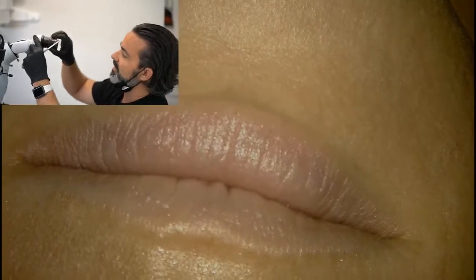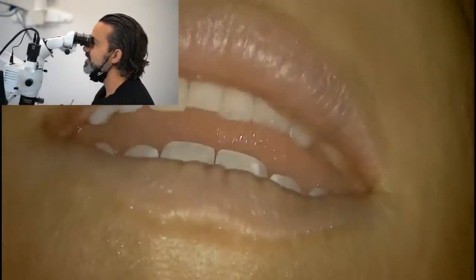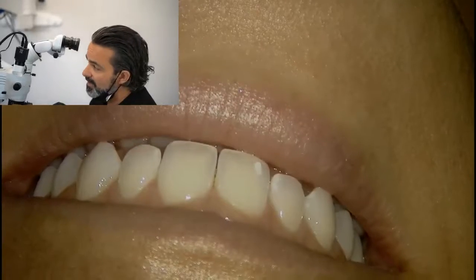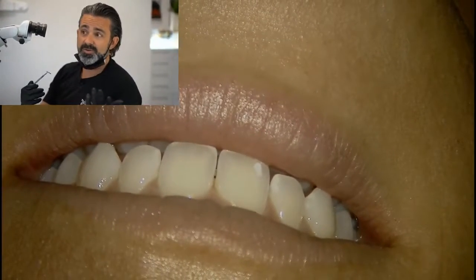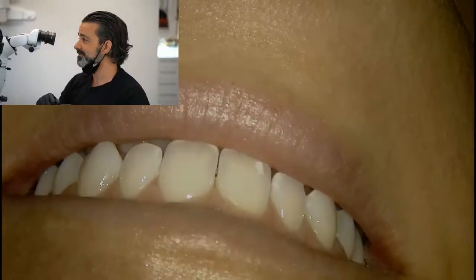That would be a plug for why you would have the caps on, because then at least your eyelashes aren't butterfly kissing the lens, and you keep it clean. But it's just the same if you wear glasses. I don't wear glasses, so if I wore glasses, that would drive me nuts. I would just cut those suckers off.